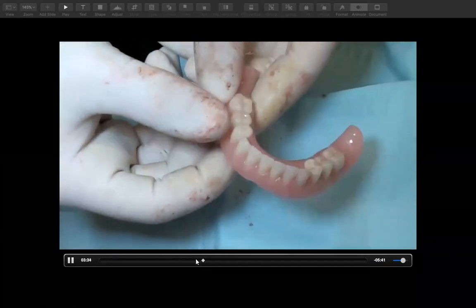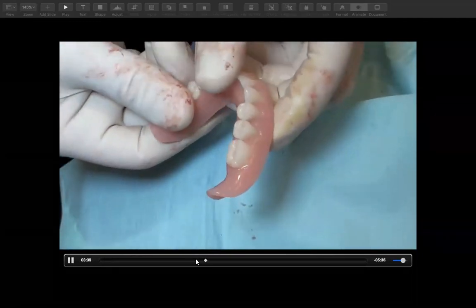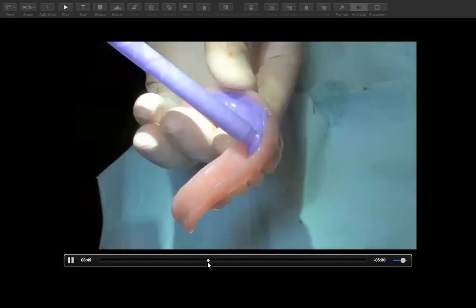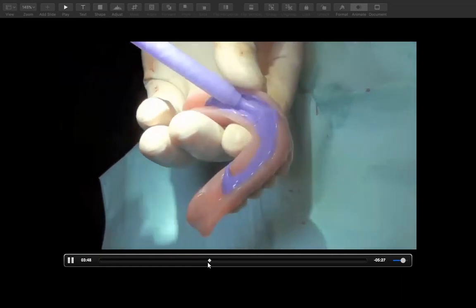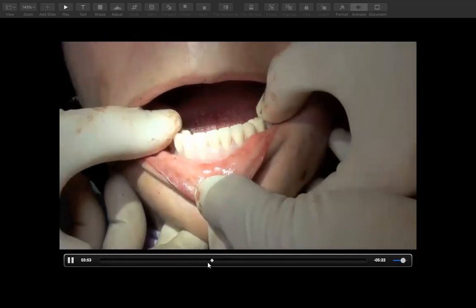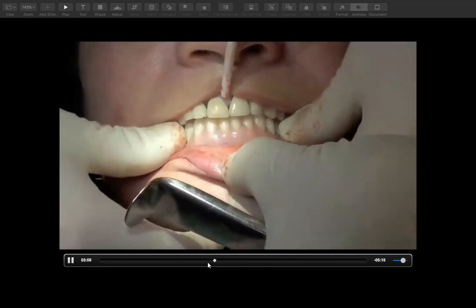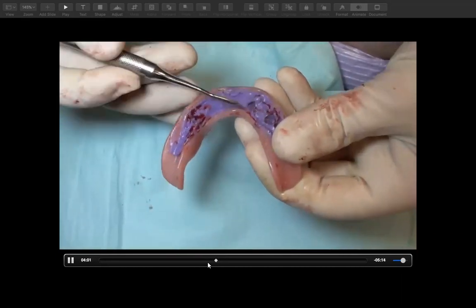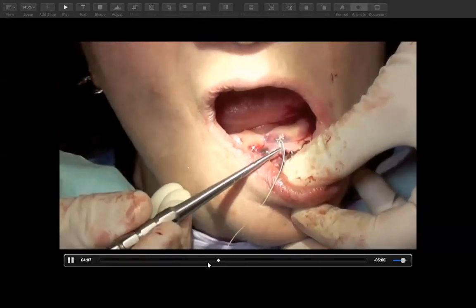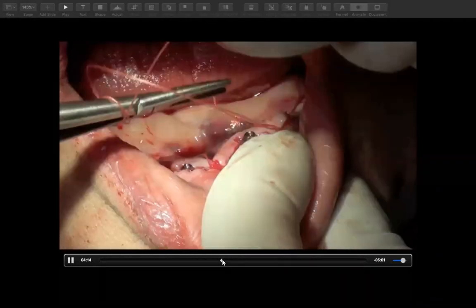Sometimes before they suture, they'll have us go in and take a wash impression inside the denture to orient us and tell us where to drill the access holes for the temporary copings that we're going to be utilizing. Here the wash is being applied. It will be seated. Then I take this back, not to the lab, but to a lab in their office or one of the surgical rooms that we can use. While they're suturing, I will create the access holes, and we're going to allow for temporary copings to be placed.